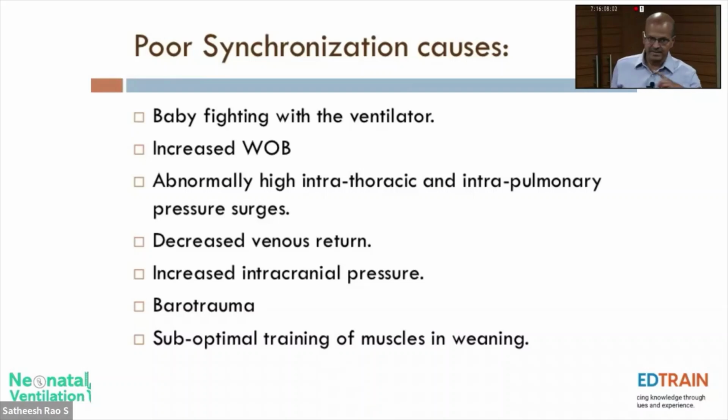And because there is asynchrony, the phasic breathing may be different. So you may not train the baby's muscles adequately to extubate. If the baby is not sedated and they are triggering the breaths and it's timing with them, the breath phase is in sync. So when they extubate, they are not confused.